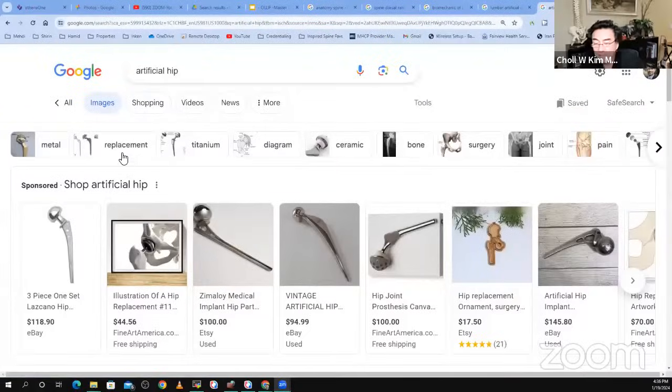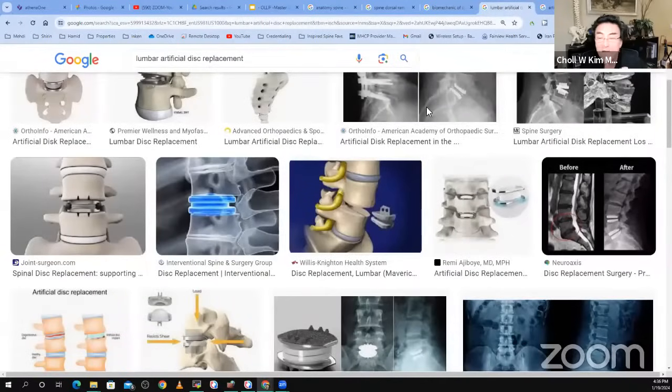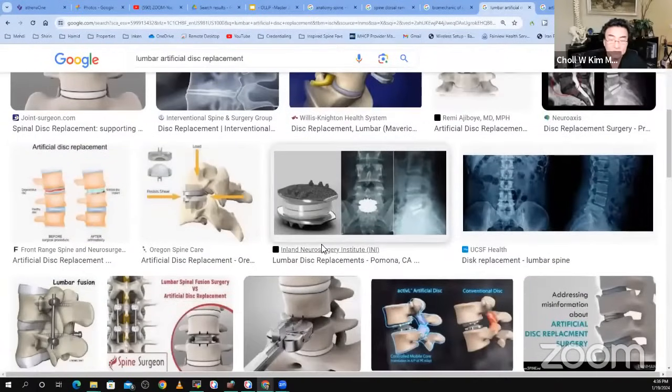And no one really knows what the problem is, but it's probably a combination of the materials that are required for an artificial disc. So in a hip joint, the cartilage is designed for being slippery, right? If you look at a lumbar disc, you don't conclude based on its design that it's for motion. It's a shock absorber. So almost all the devices that are out there look like little knee and hip replacement devices. They don't look like shock absorbers. So the whole design parameters are kind of wrong.